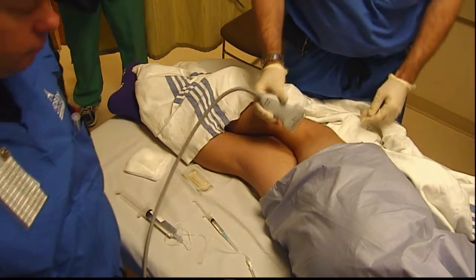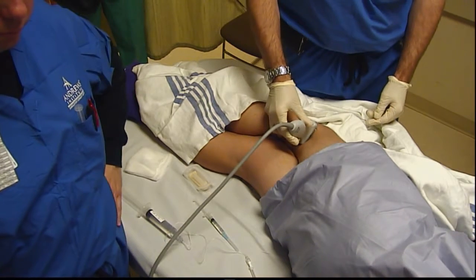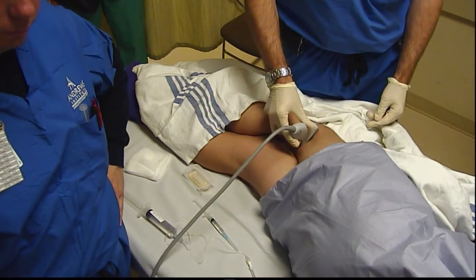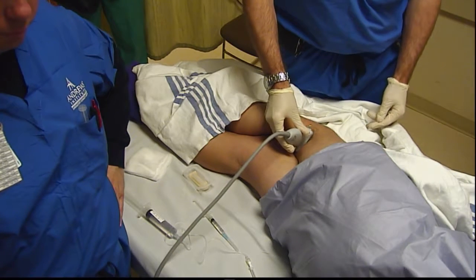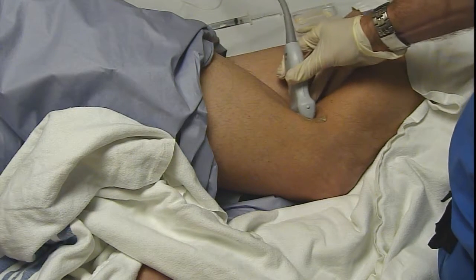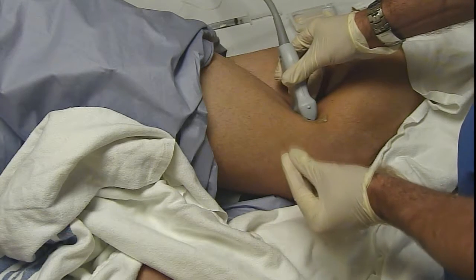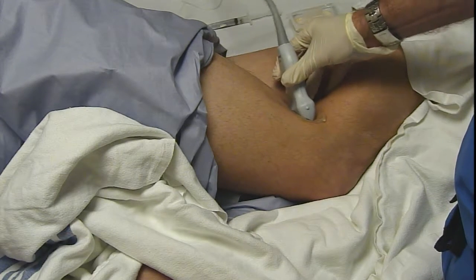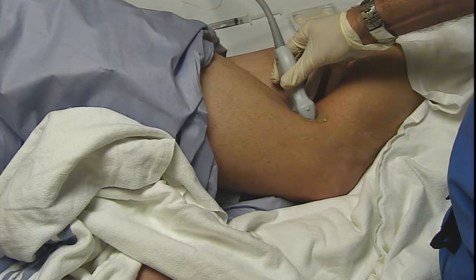All right, so we'll start by scanning at the popliteal crease, as you can see in the main camera there. Usually they angle the beam a little bit towards the toes to get the brightest view of the nerve. And we try to find the popliteal artery, and I'll give you a couple of shots here. Shot of the ultrasound probe from behind. This is where my needle is going to be coming in. And again, notice the angle of the beam towards the toes gives me a brighter view of the nerve.